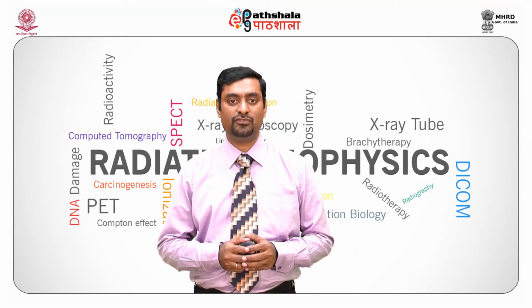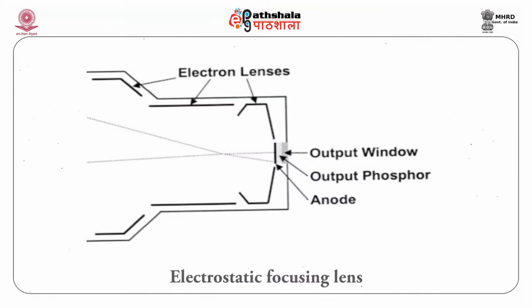Then we have the electrostatic focusing lens. A potential of about 25 to 35 kilovolt is applied to the electrode, and an anode plate is placed inside the glass envelope. The electrodes focus the electron beam from the photocathode towards the output phosphor, because electrons can be accelerated by electrical and magnetic fields. The electrostatic focusing lens inverts and reverses the image on the way to the output phosphor, as seen in the image. The energy of each electron is substantially increased and gives rise to something called the electronic gain.